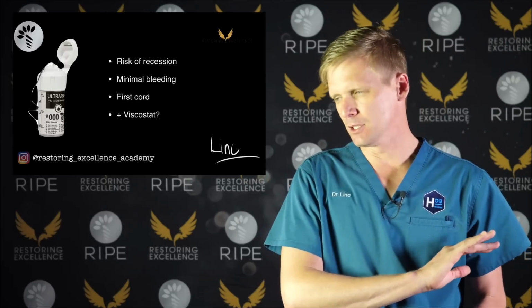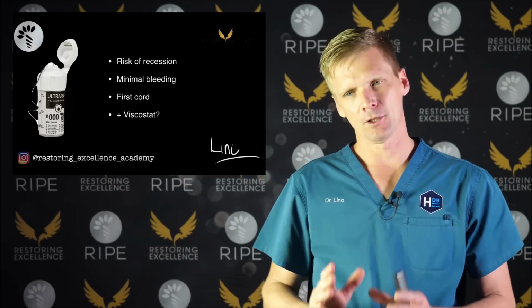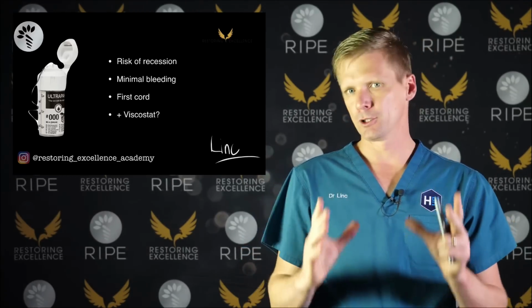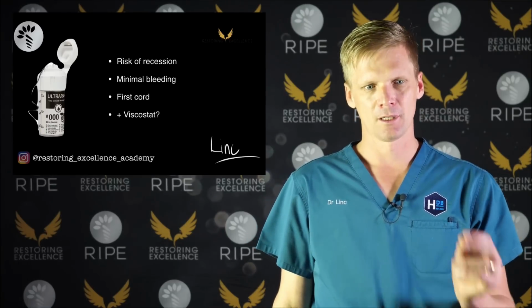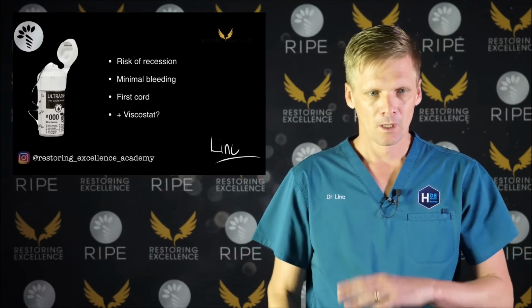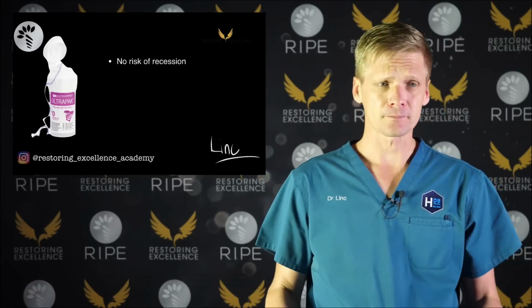If there was absolutely no bleeding, the tissue was perfectly healthy, and I was just packing a cord to push the gingiva or to stop a little bit of crevicular fluid coming up through the sulcus, then I would use it without Viscostat. But I would say 90% of the time in my practice, I'm using this cord with Viscostat. Be careful about how long it stays in the sulcus, because if you leave it too long, you can get recession.